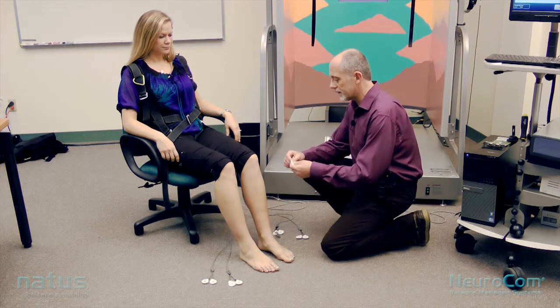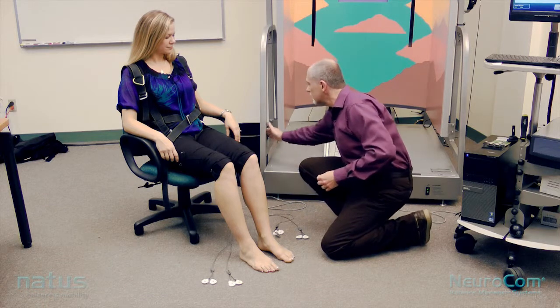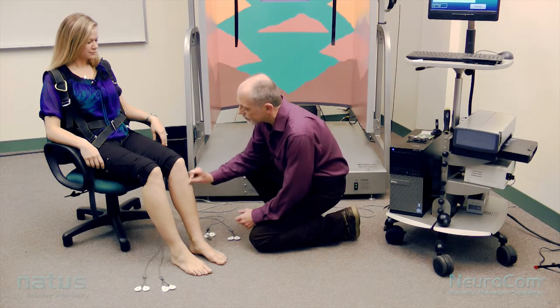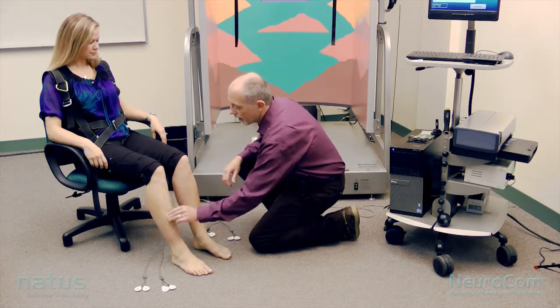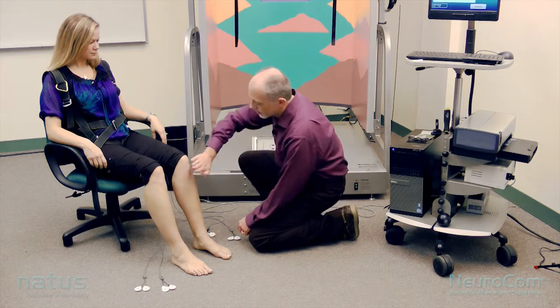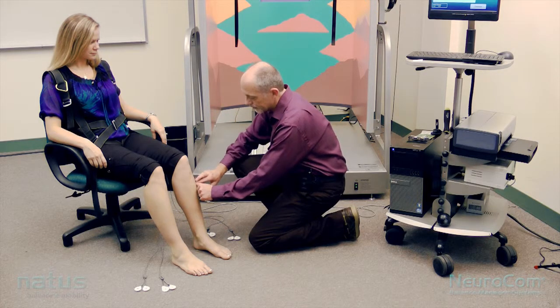This is a demonstration of the Postural Evoked Response option for the Neurocom dynamic force plate test. Probably the most difficult part about the PER test is electrode placement. Once you get the electrodes placed, performing the test is actually pretty easy. This is a large muscle response, so you don't need to do a whole lot of preparation before electrode placement — primarily just cleaning the skin where the electrodes are going to be applied so that they'll stick well. I rarely need to use any electrode paste; just clean the skin with an alcohol swab and let it dry.